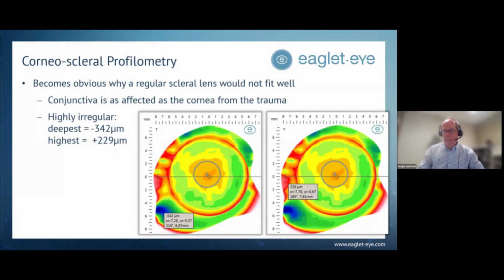So we did a scan. Obviously, the first thing we did, just to understand better that case. I have very competent colleagues here in Montreal, and the one who fitted that sort of lens, they mentioned his name. It was obviously in the papers I received. He's a fabulous practitioner, and I had no doubt that he did everything to have the perfect fit with scleral lenses. So I wouldn't want to just go with the same scenario, especially looking at the mishandling of that lens from the kid and the drama that causes.